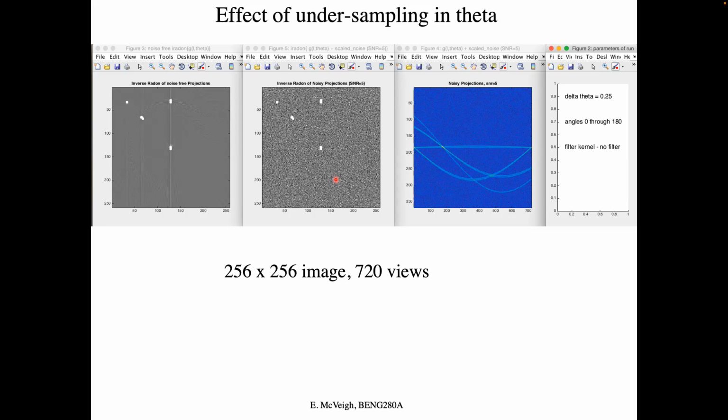So that demonstrates variance as a function of 1 over m went from 360 to 720, and the noise goes down, right? So it's just like averaging measurements together at that point.